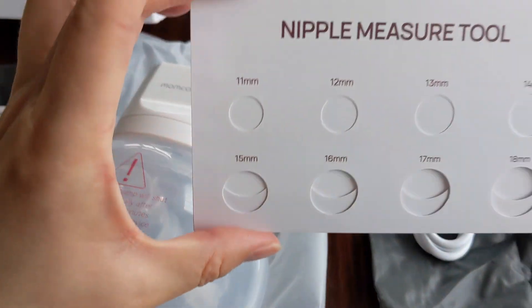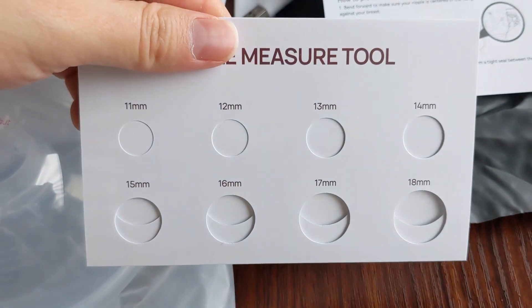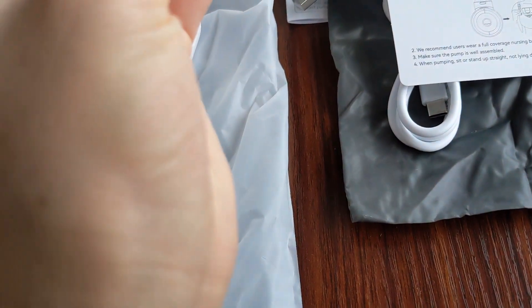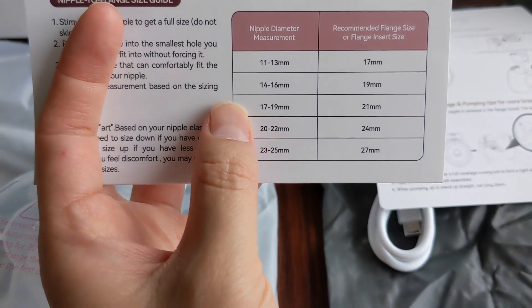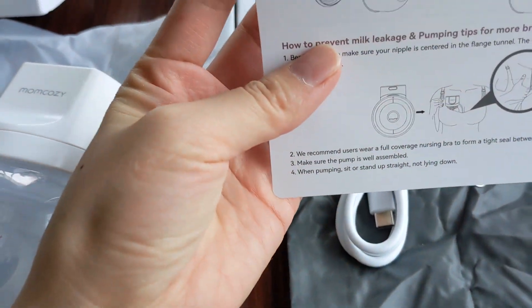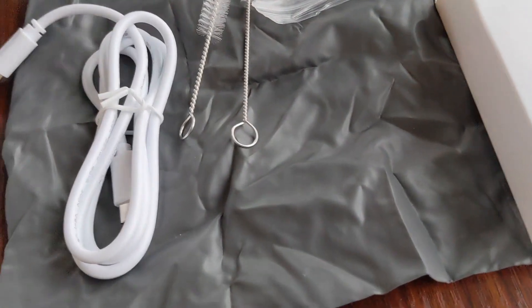It also comes with the nipple measurement tool, which is handy if you don't know what size flange you need — based on your nipple diameter measurement it gives you the recommended flange size. This card is basically instructions on how to put it together, and then this is the user guide. And yeah, that's the nursing bra clip and valve I initially missed, plus the charging cable.